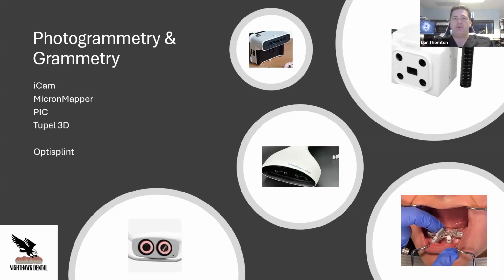Most of the time when I'm doing live surgeries, I'm actually running off of exocad with a pre-designed temporary that's just waiting for it, because I normally have the case at least a month in advance. So I have time to do a wax up, get everything ready for it. And then I just start waiting to get all the scans with all the scan markers and everything else so I can start stacking the case to get ready to do the final or the surgery temps, which makes it easier.